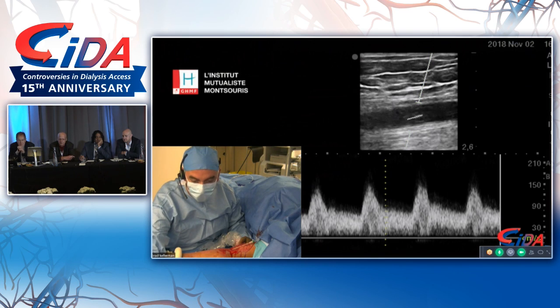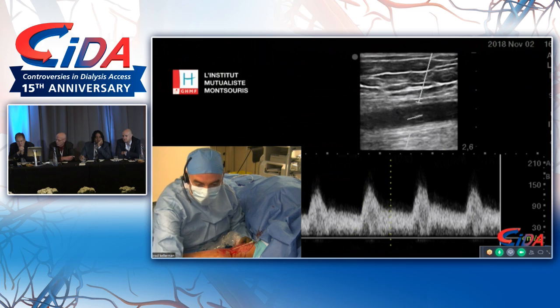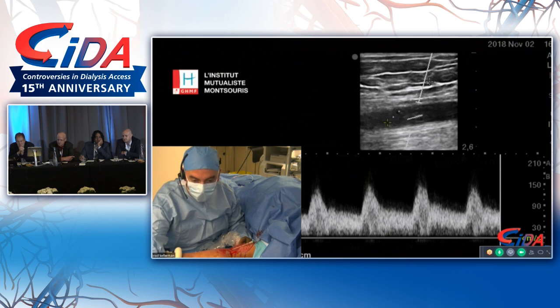He also sort of pioneered the all-in-one maturation. So he had balls of steel and just went up there and ballooned that thing. Oh, he's awesome. And didn't worry about it. Initially, when we used the balloon, we were just treating spasm. There's always recoil and there's always spasm when you put this device in, and we were just trying to affect that. And like I said, Alex took the technique and the overall results to a new level. So thank you, Alex. That was fantastic.